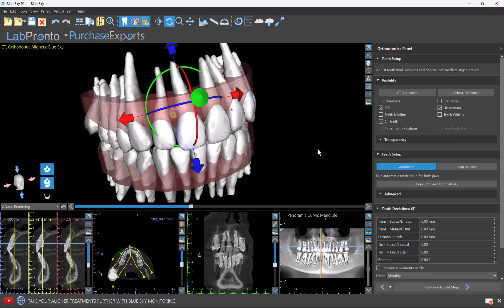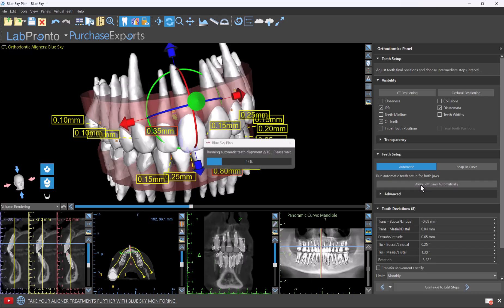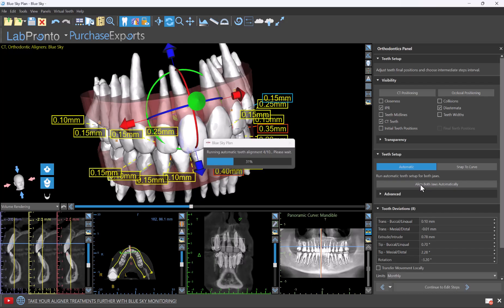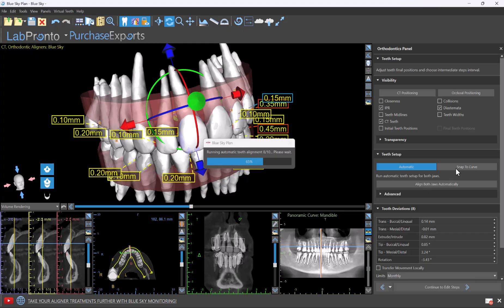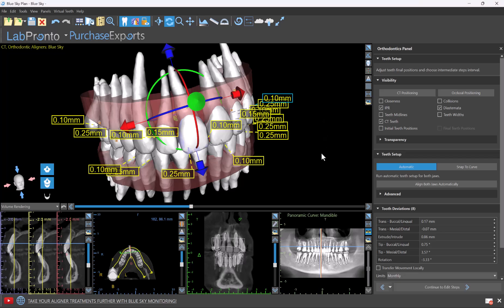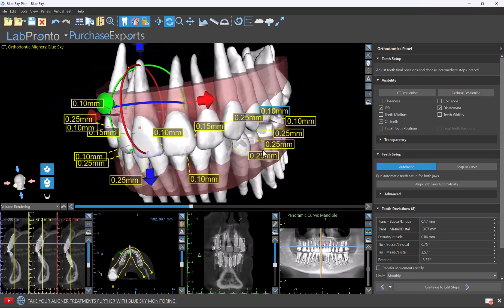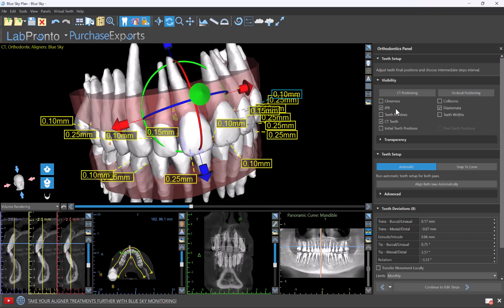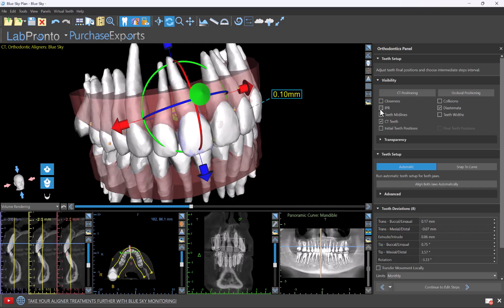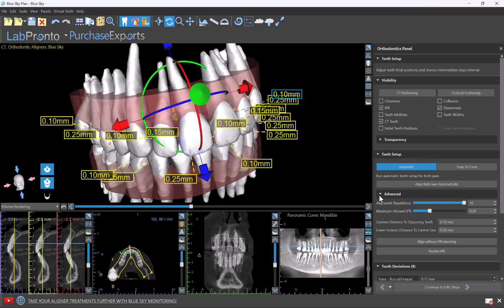Blue Sky Plan now includes an initial AI digital tooth proposal. With or without the CT teeth, simply click 'align both jaws automatically.' This is new functionality in addition to our previous functionality to snap the teeth to a curve. This is our first iteration of AI functionality to prepare the digital tooth proposal. We can toggle on and off the IPRs and the diastemas, and in the advanced settings we can see additional settings regarding maximum allowed IPR that can be adjusted accordingly.